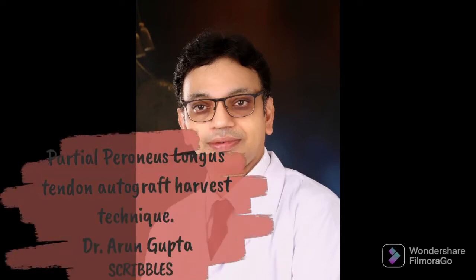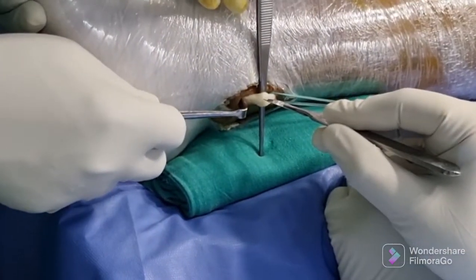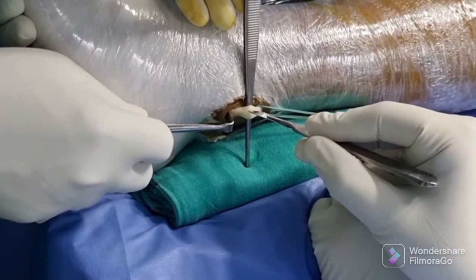Friends, we have seen a phenomenal rise in the use of peroneal longus autograft. Here we will demonstrate the extraction of partial thickness peroneus longus graft.